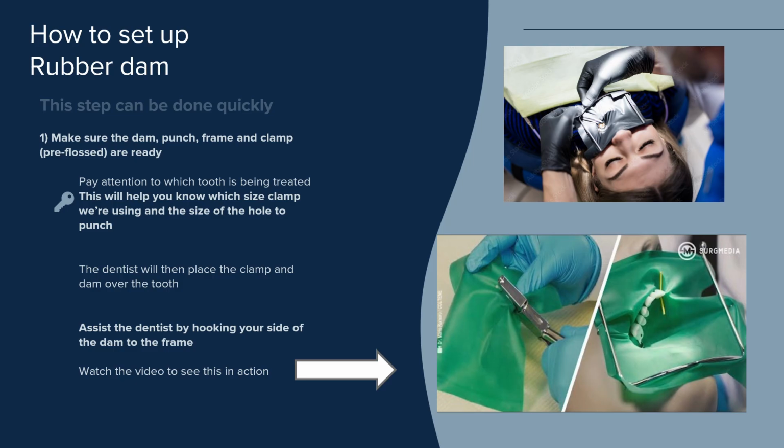You can see the holes go from big to small. Now they're going to get their clamp, I believe. That's the bow. The different types of clamps are winged and wingless. This is a wingless, so you can go from underneath.